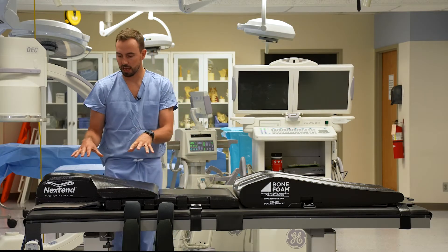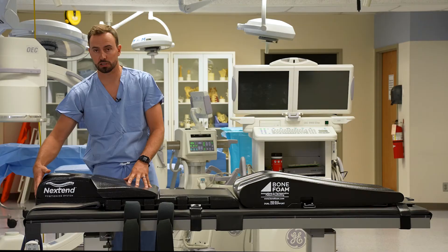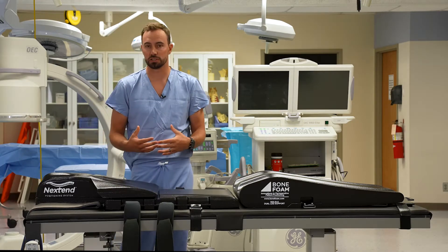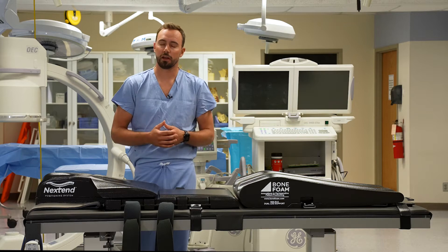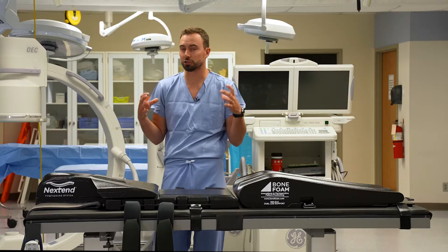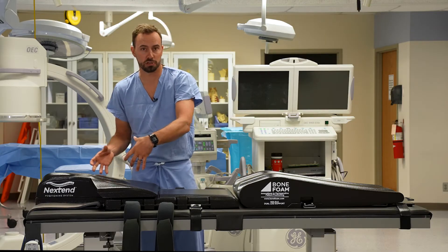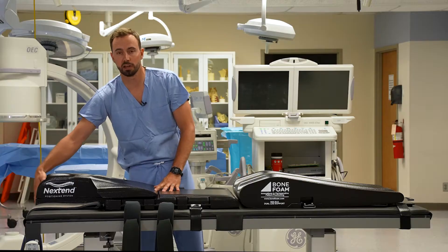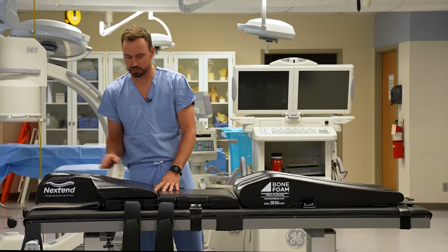When positioning this on the table, the head portion should be as close to anesthesia as possible. One thing you'll want to do is confirm with anesthesia what type of cervical positioning the surgeon prefers. Some will use a head halter traction where it might need to be positioned a little lower. Always confirm with anesthesia where the most cephalad portion of the positioner is going to go — most commonly right at the edge of the table.